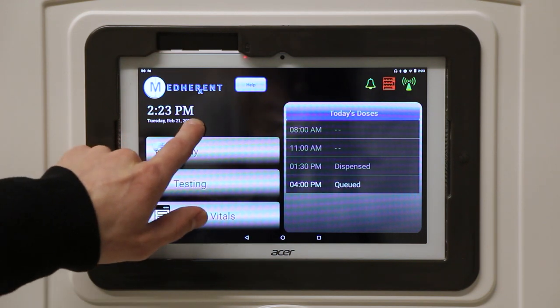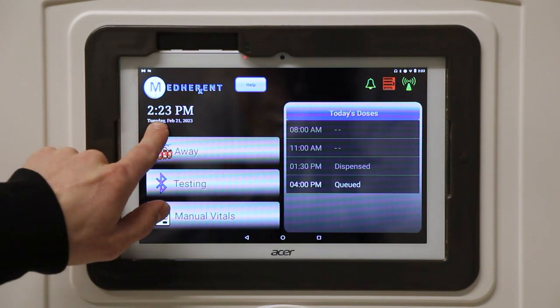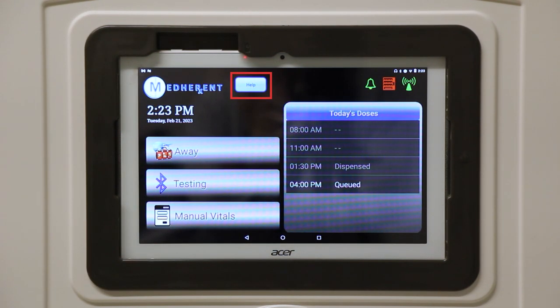The time and date are listed here. This help button pulls up a pop-up screen that has the Terrapin Pharmacy 24/7 helpline phone number.